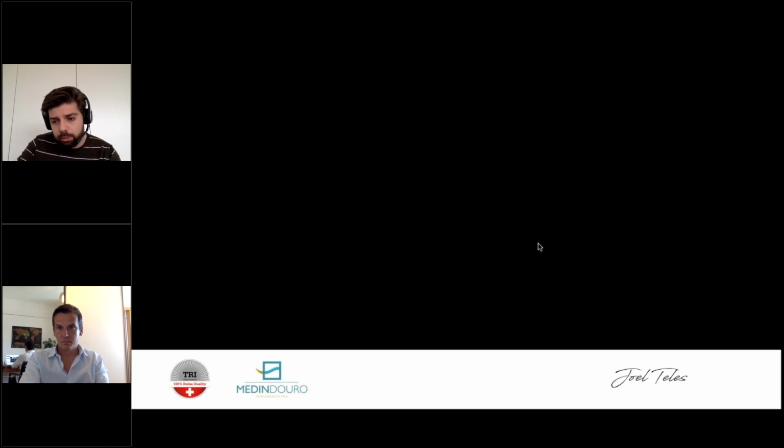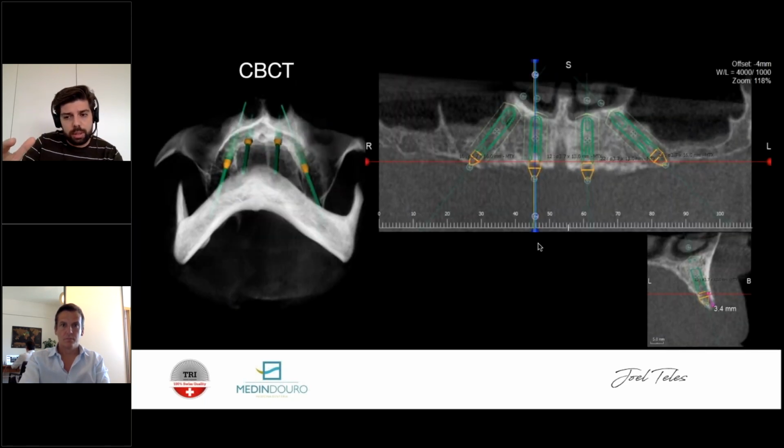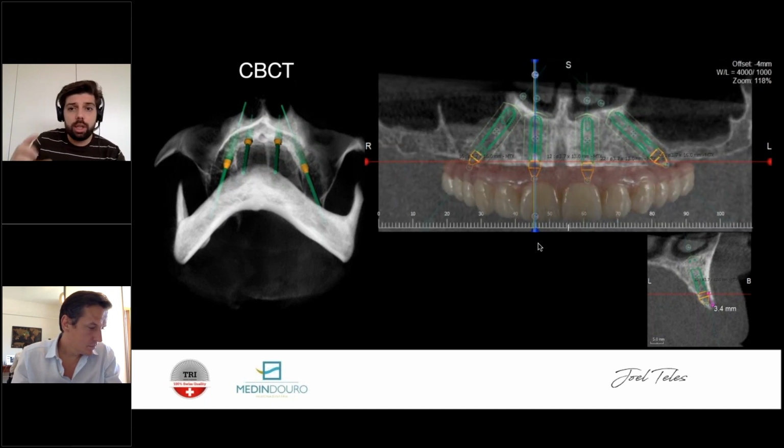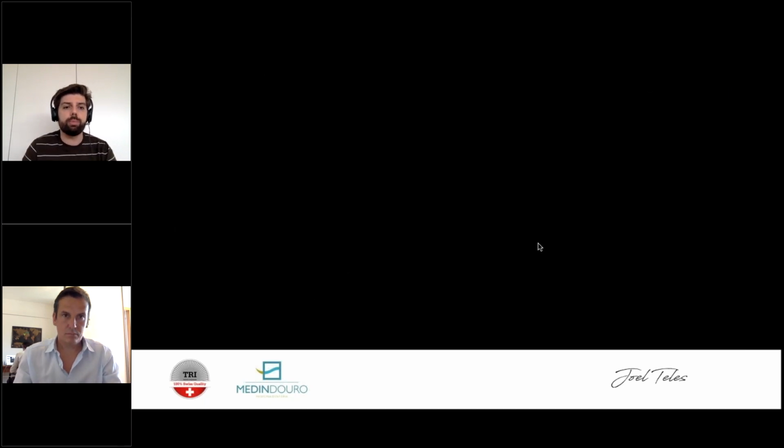So first of all, make your provisionals. That's what leads you to understand where you need to create your shelf, and if it means bone reduction or not, and how much bone reduction it means, so you can transfer that to the virtual world when you're planning your surgery on the CBCT, thinking that you need prosthetic space. You need these transition lines to be hidden, okay? So there are several ways to transpose this. I already discussed this, but always keep this in mind, because I still saw people asking, why should we reduce bone?